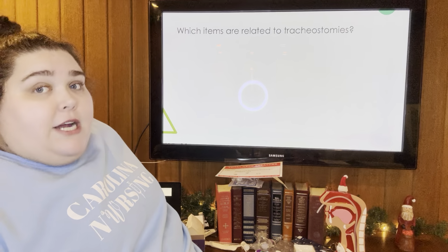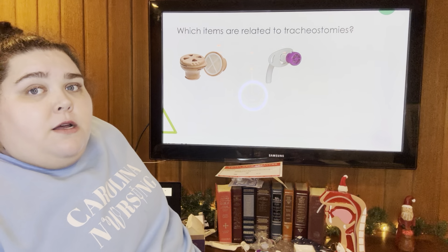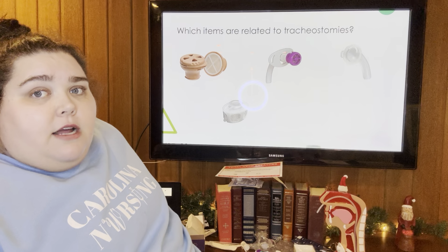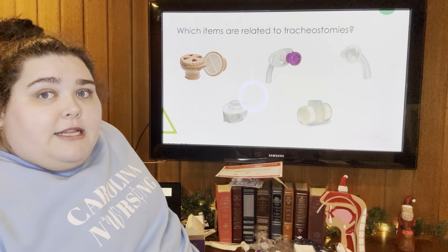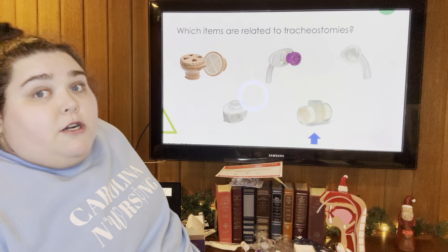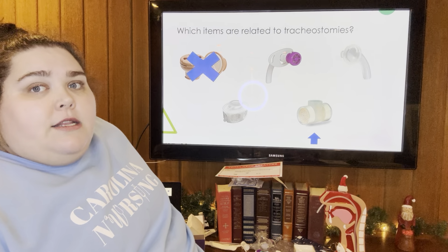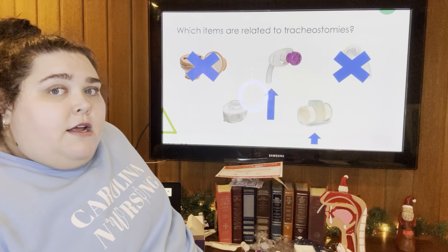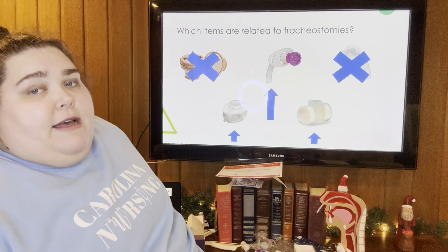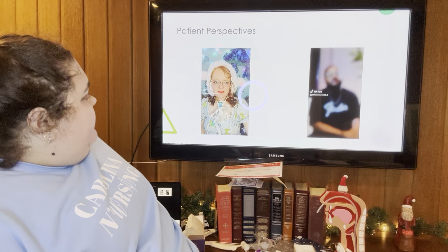So your knowledge check: which items are related to tracheostomies? We've got a few different pieces here. This one in the bottom right there is related to the trach. The top left is not. The top right is not. And then that middle one is, and the bottom left one is as well. So we're going to listen to 2 quick videos, and then that will be all.